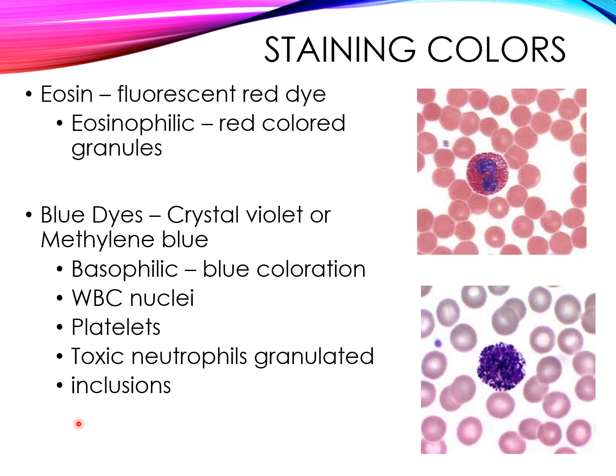So the white blood cells, all of them take up the basophilic dye for the nucleus part, and then if there's any granules, like neutrophils as well have granules, but they're not always as visible unless it's a toxic neutrophil. And then also red blood cells may have inclusions like Howell-Jolly bodies. There's none here, but we'll get to that, which also take up the stain.